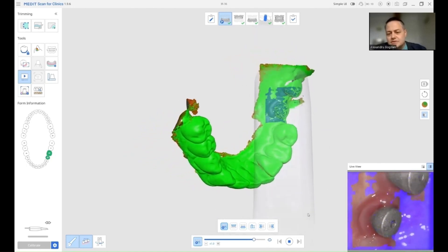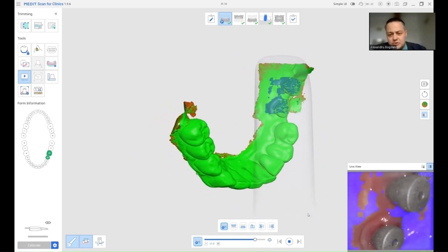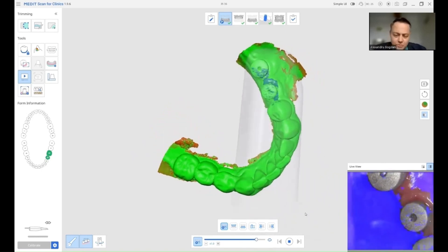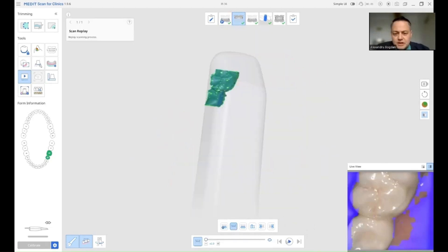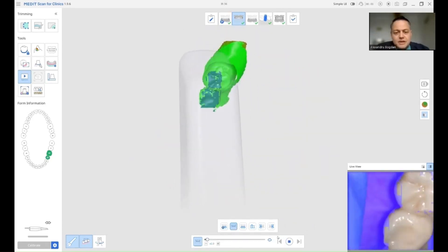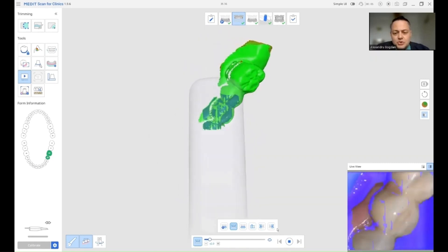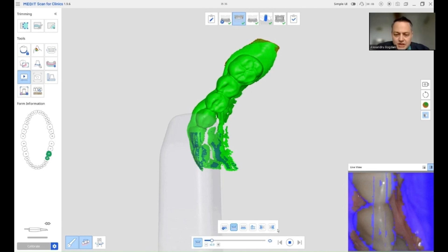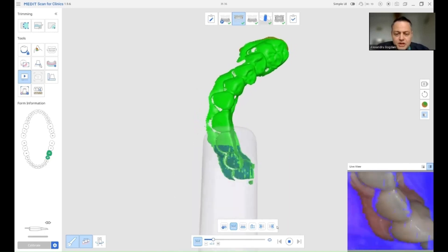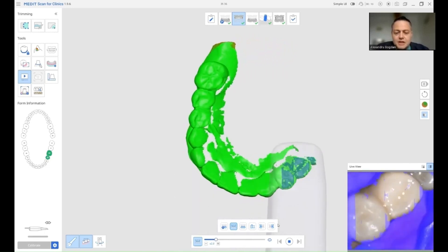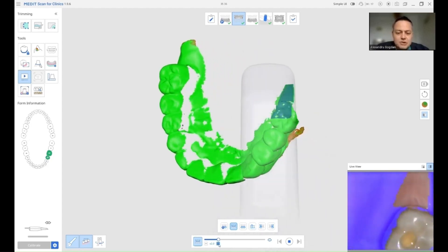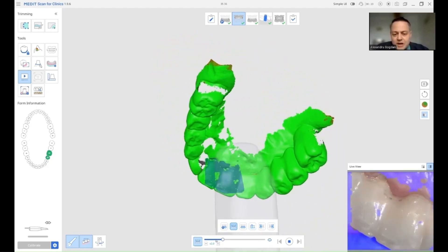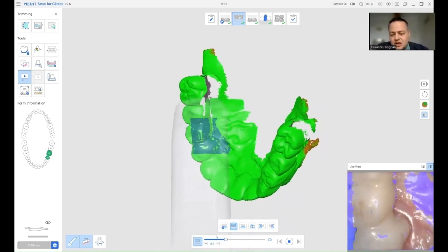Afterwards, I am going to stop again, optimize again, as I will scan the antagonist. We will try to image the occlusal surfaces of the lateral maxilla and also get some parts of the papilla. In the middle portion, I will angle my scanning tip from buccal to palatal until I get all the information I need.